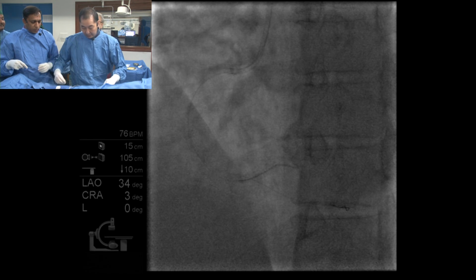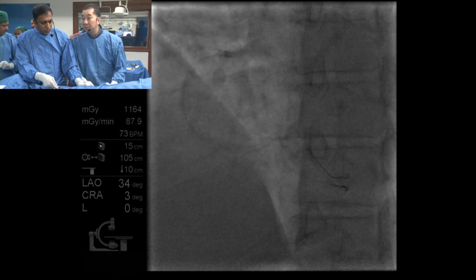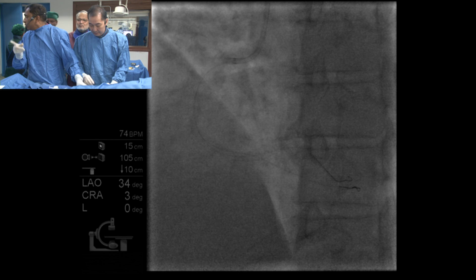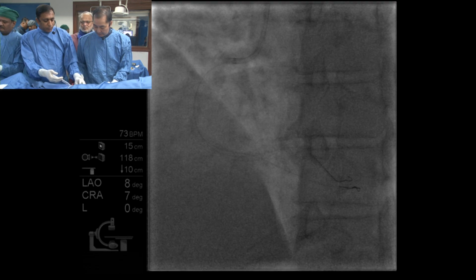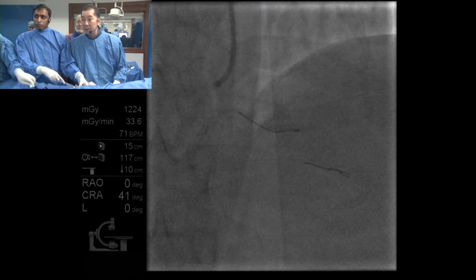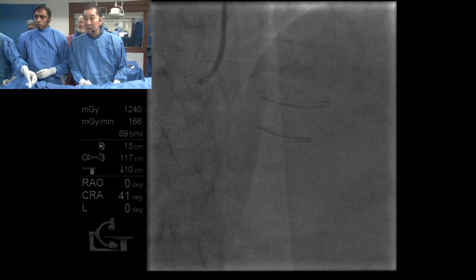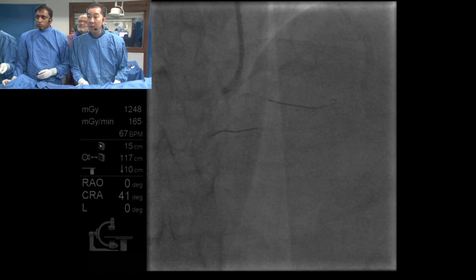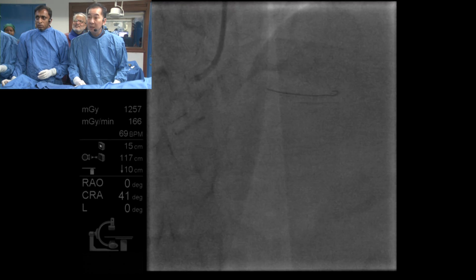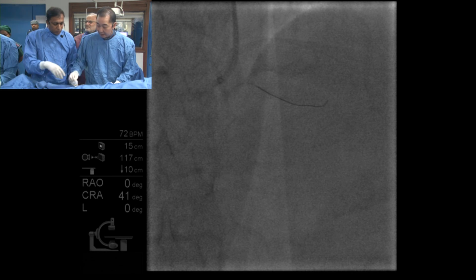So I did have a situation where I had used a longer stent in the main branch, and the side branch balloon after deflation would not come out easily, and the guide catheter was driving in. At that point, it becomes a bit stressful that the guide can go too deep and can cause dissection. So it's very important to avoid just pulling it out. You take the side branch wire very slowly, avoiding the guide jumping in. Many times the wire should not be jailed by the pot. So let's do an OCT again.